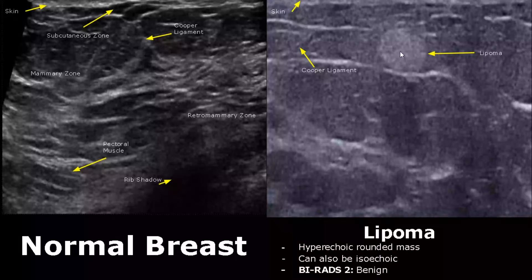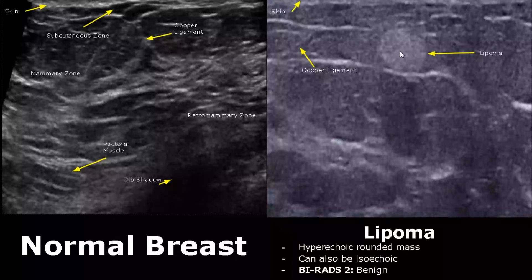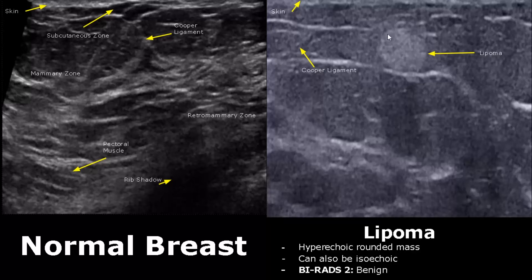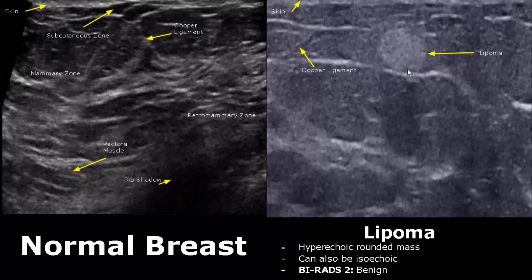A lipoma will appear as a hyperechoic, rounded mass. Usually hyperechoic rounded masses are benign. It has a BI-RADS score of 2. Despite this appearance, routine screening mammography should be done.